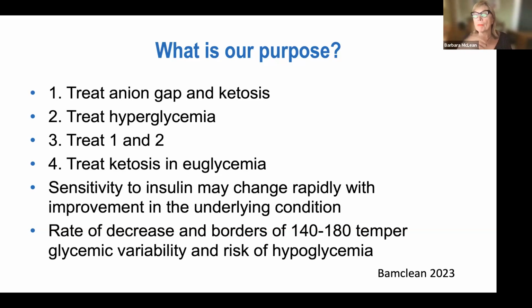And I also want to remind you, no matter who you're taking care of here at Grady, whether it's a CTS patient, an adult patient, anyone else, our target range at Grady is 140 to 180. We have a CTS profile. Dr. Ward does not want us to use it. She would prefer we never use it. She has asked me if I can remove it from Epic. I have made the request, but it is part of the Glucommander algorithm, so I may not be able to obliterate it, but our target will always be 140 to 180.